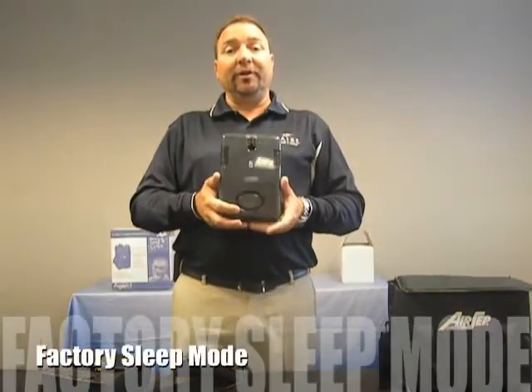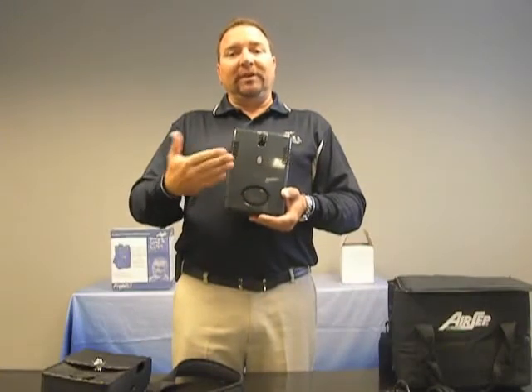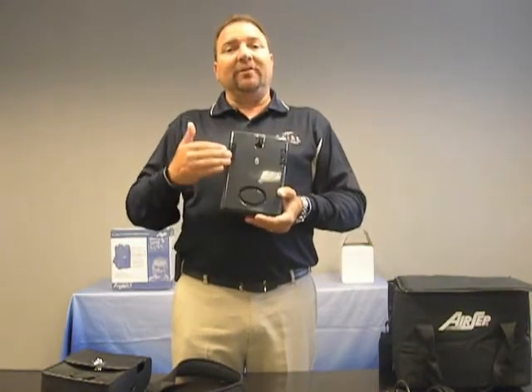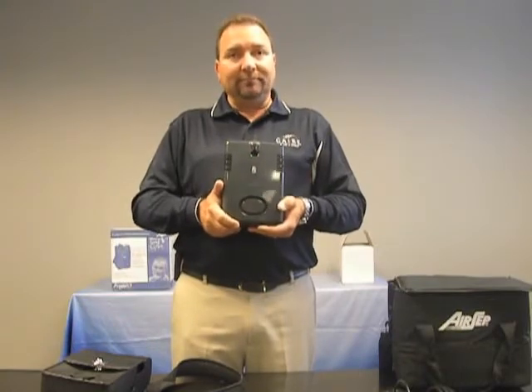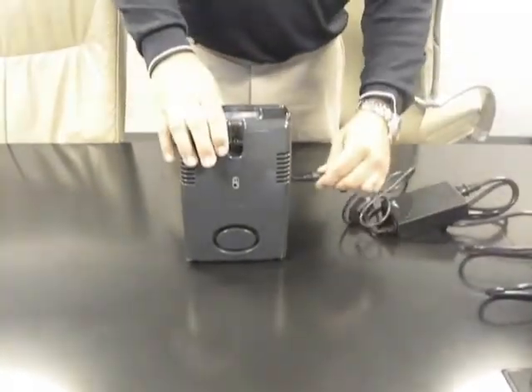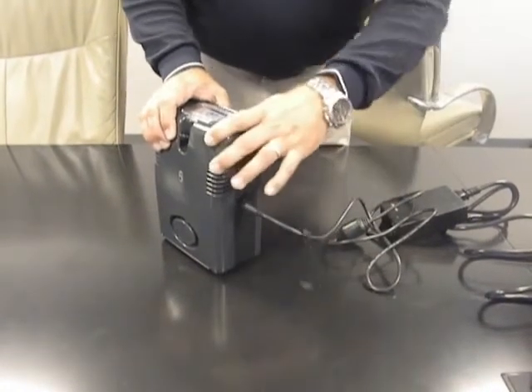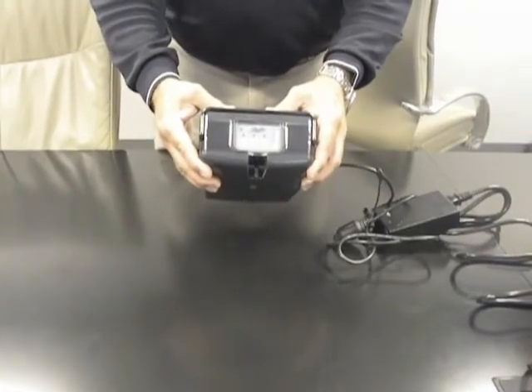All Freestyle portable oxygen concentrators are shipped to you in what we consider sleep mode. When we leave the factory after testing, we disconnect the cables on the battery, which allows the battery to have a longer shelf life. It is very easy to remove the Freestyle from sleep mode by simply attaching the AC power supply connector to the Freestyle and plugging it into a wall outlet. Connect your AC power supply and align the button at the very top, sliding the universal power supply right into the side. All of the battery lights will now be illuminated and your Freestyle is ready to operate and out of sleep mode.